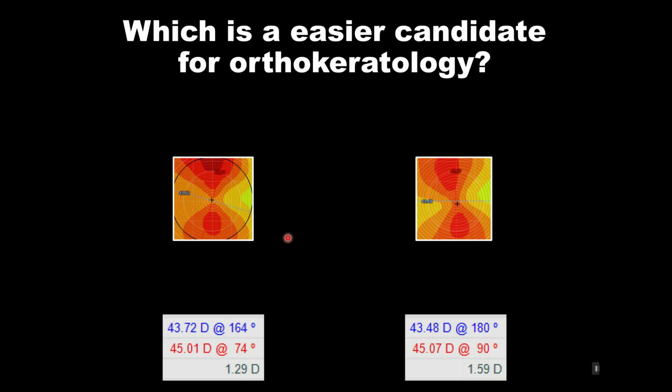And let's look at these 2 different eyes and just look at the center, especially the way K readings would interpret this patient. We would get a 3 millimeter ring to provide us with the corneal astigmatism in the center. In this case, this eye has around 1 1/4 diopters of corneal cyl. That would be 0.25 millimeters of corneal cyl. On this patient, we have about 1 1/2 diopters of corneal cyl. This patient, similar to 0.3 millimeters of corneal astigmatism for those that think in millimeters.